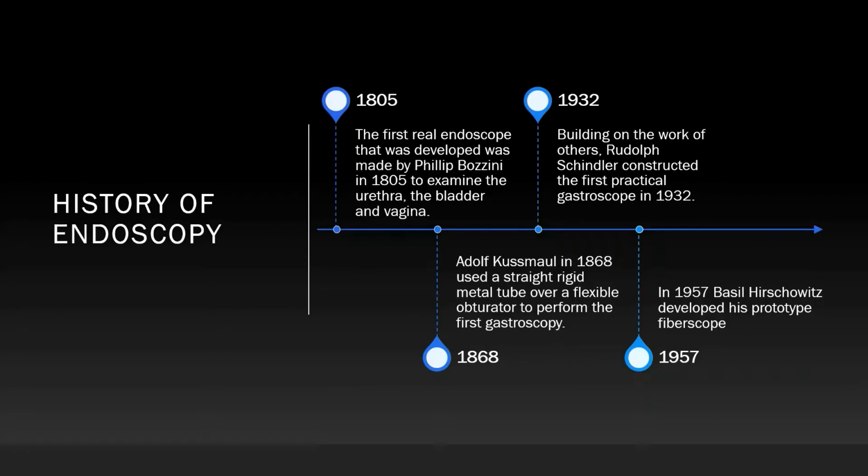Traditional endoscopy has evolved over years, but has not been enough to find the diagnosis of disease of the small and large intestine. Reaching and examining that organ with the traditional endoscopy method was impossible for both patients and doctors. Capsule endoscopy has come as an invention that facilitates these situations.